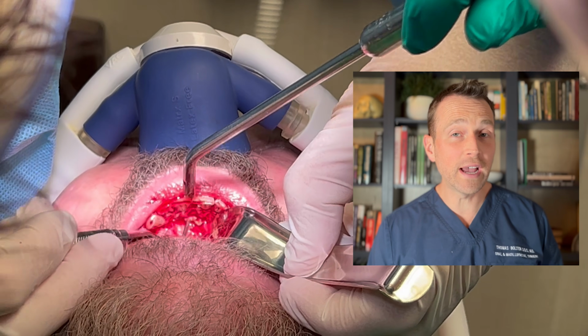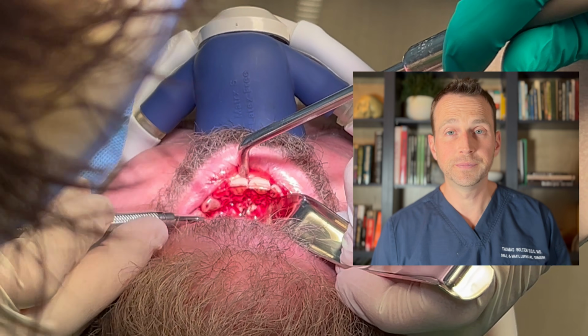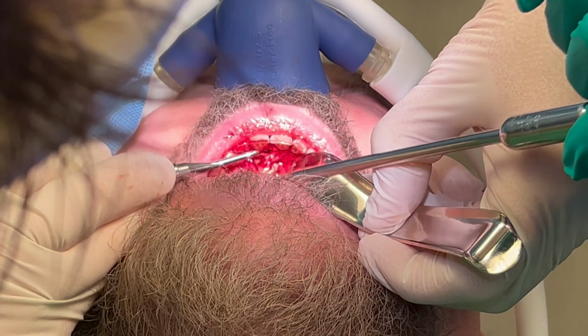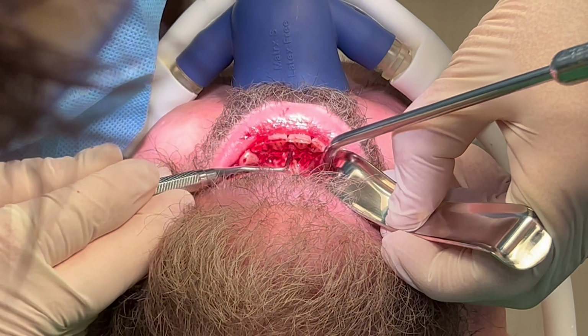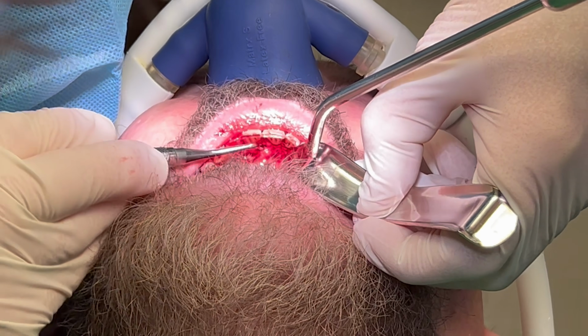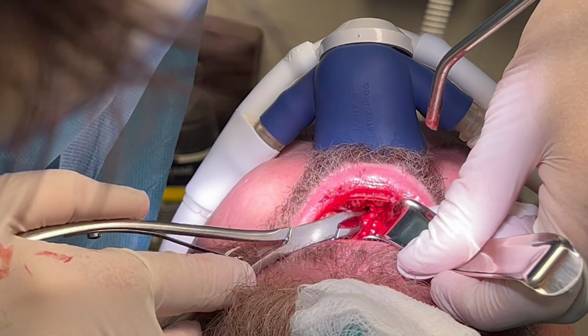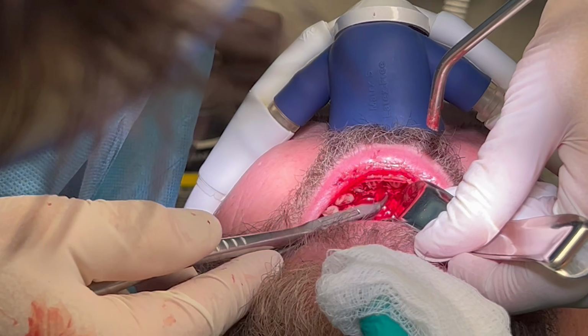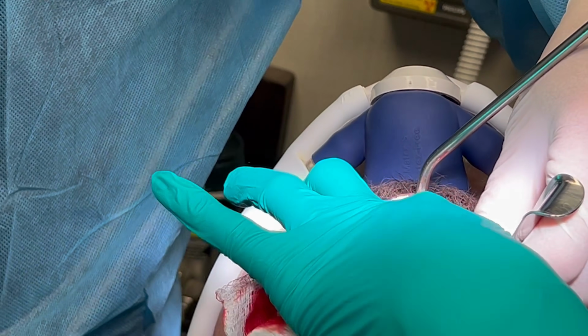I use a curette to free this lesion from the bone and then a rongeur to remove it. These contents go in the pathology jar.